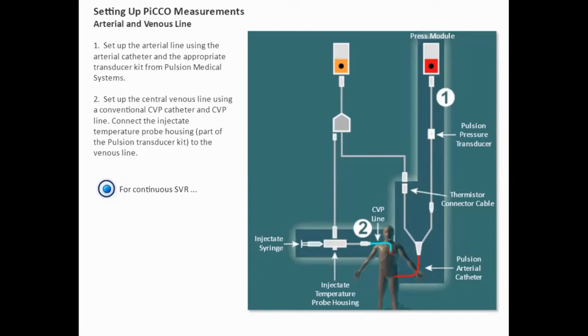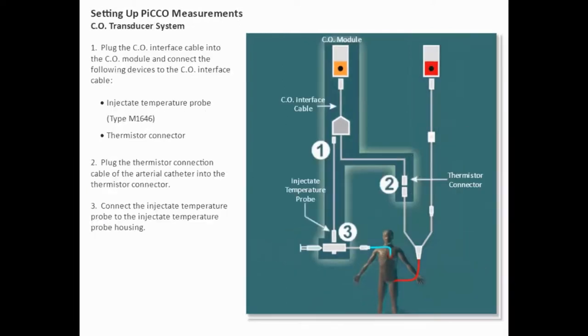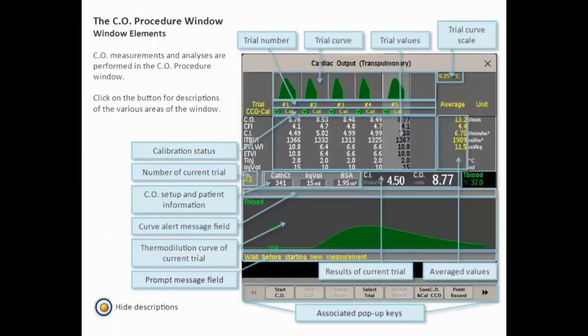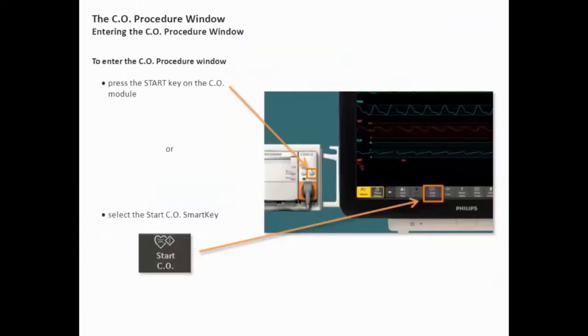So you all can see this setup, but when we come to the monitor, you will understand it better. Then the next step is to connect the injectate temperature probe to the injectate temperature probe housing. And then a menu, a display like this, will pop up that is for setting up the continuous cardiac output. So I will go to that. Rather than doing it from the presentation, I think it would be better if I do it from the monitor.